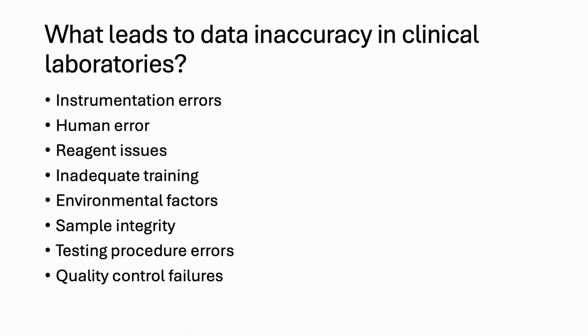effectively. Various factors contribute to data inaccuracy in clinical laboratories, including instrumentation errors, human error, reagent issues, inadequate training, environmental factors, sample integrity, testing procedure errors, and quality control failures. We'll briefly discuss each of these points.